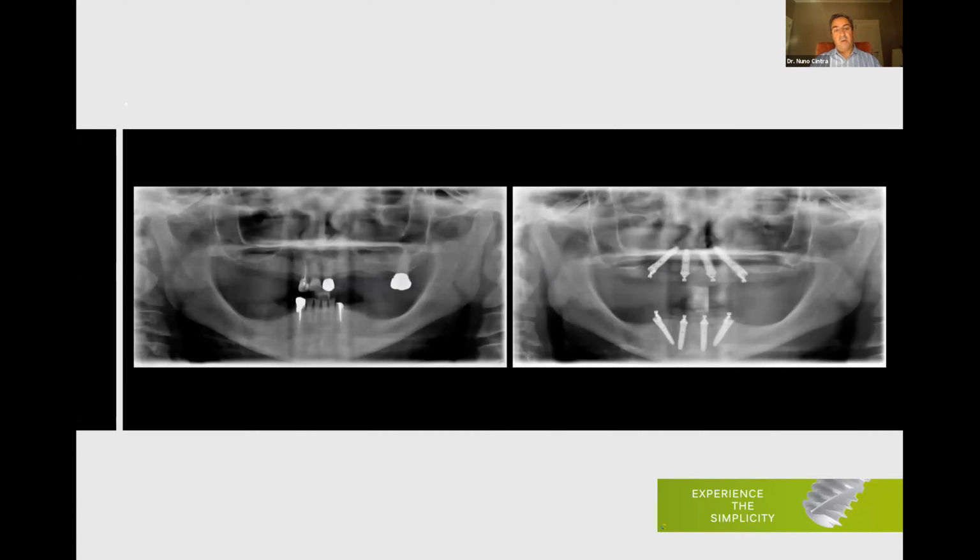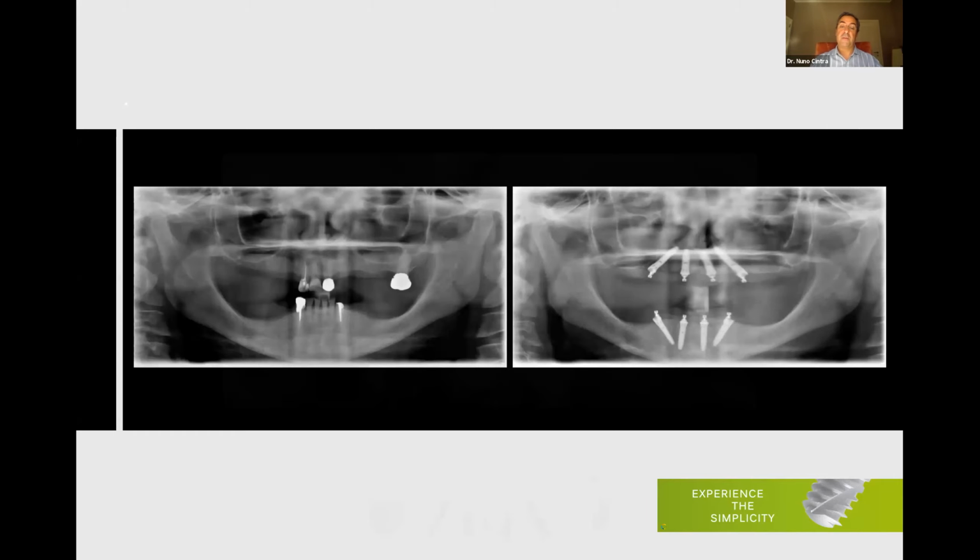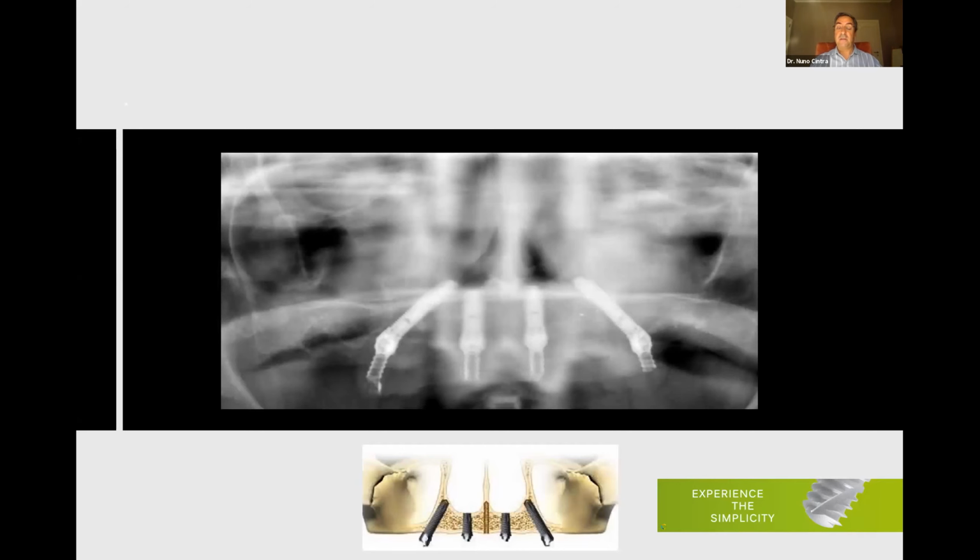Well, as you saw now, in most of the cases, we have to cut bone. When we cut bone, we lose one of the corticals. So we will not have bicortical anchorage, which is the best way to anchor our implants. So we need to reach at least one cortical. And the cortical that is left for this kind of approach is the nasal floor cortical. But in some patients, to reach the nasal cortical, we need long implants. And this is even more important if we are dealing with soft bone, because in soft bone, the tip of our implant has to find the cortical. We cannot leave our implants in the medulla because otherwise we don't have enough stability. So sometimes, in order to reach the nasal cortical, we need long implants, in the region of the 18 or 20 millimeter implant.